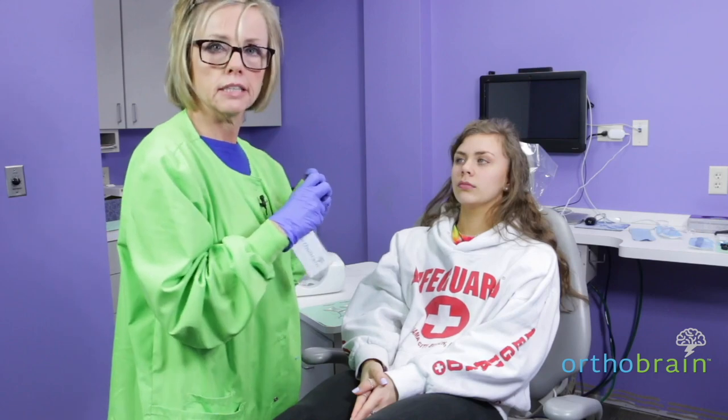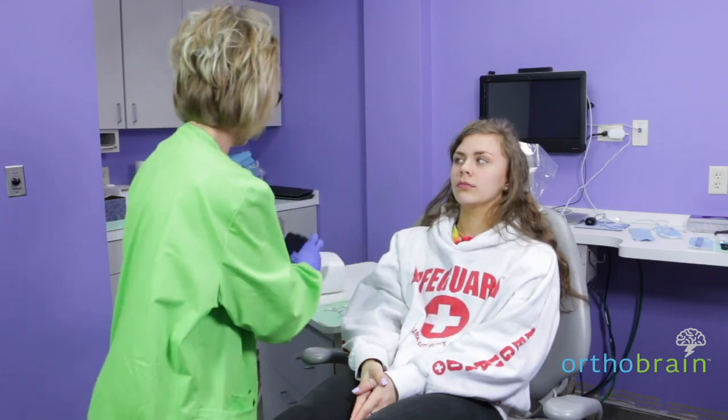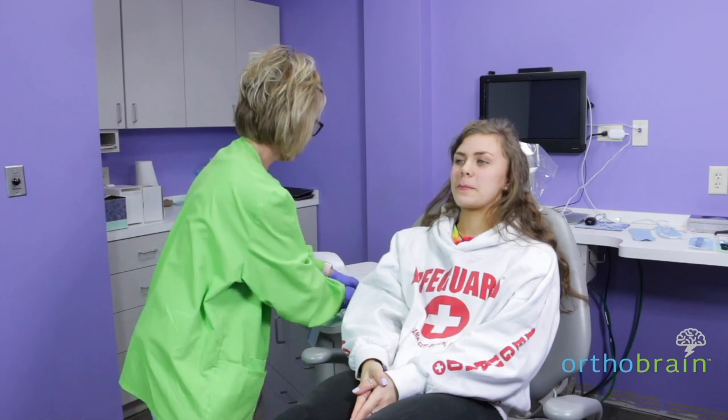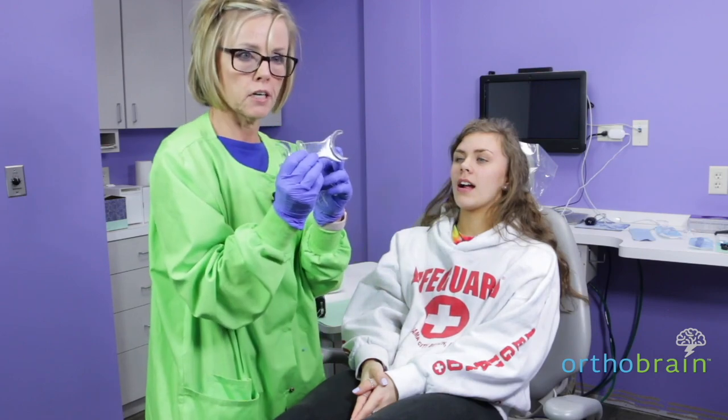You want to be about seven inches away from your patient. I am going to have Miss Emily put some lip stretchers in. We're going to use the larger end first.